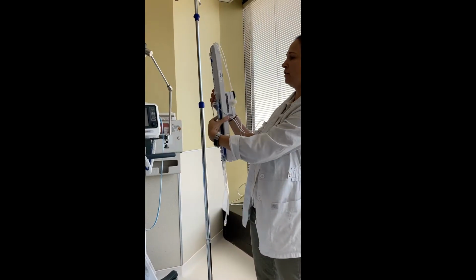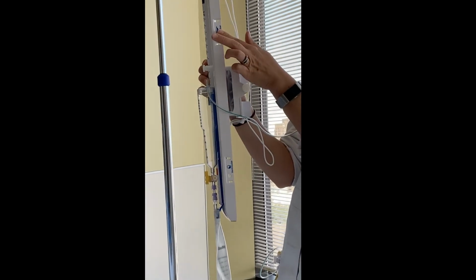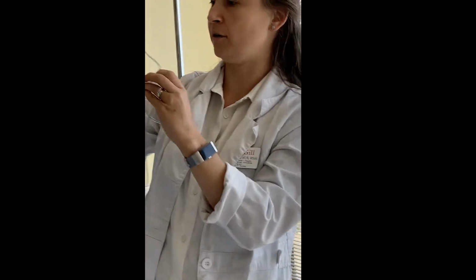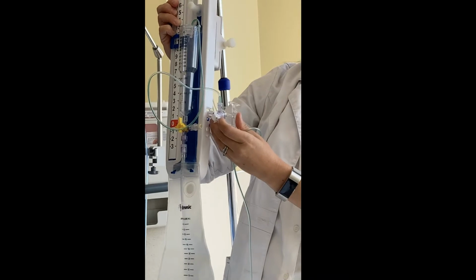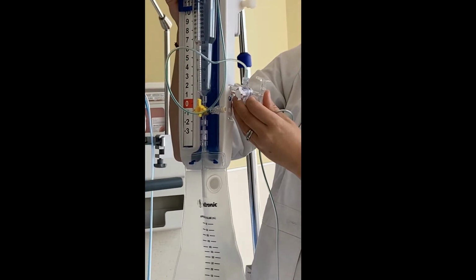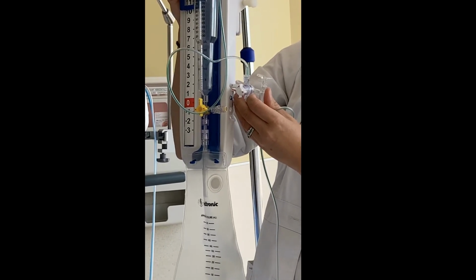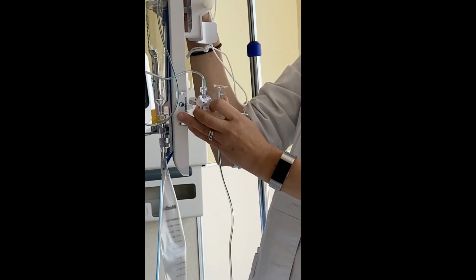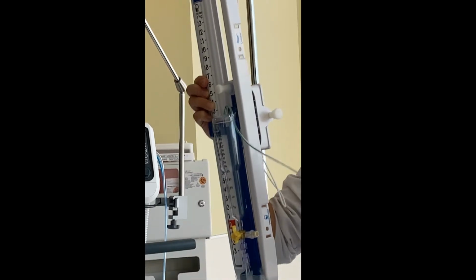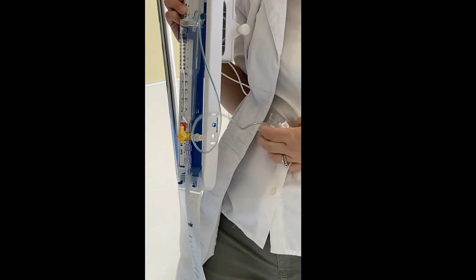Then if you look here, you have ventricular drainage and lumbar drainage slots, and this is where you will attach your tubing and your transducer. As a reminder, a transducer is your fluid air interface that will actually allow you to measure intracranial pressure. So it will be attached here for ventricular drainage or here for lumbar drainage. So I'm going to attach my clip, and then we're going to set up the system.